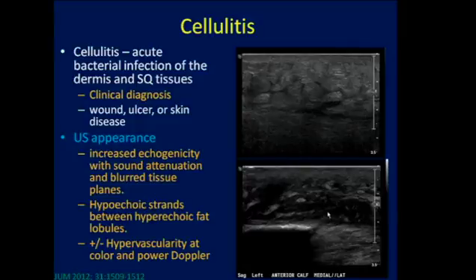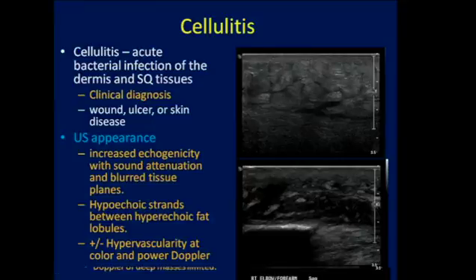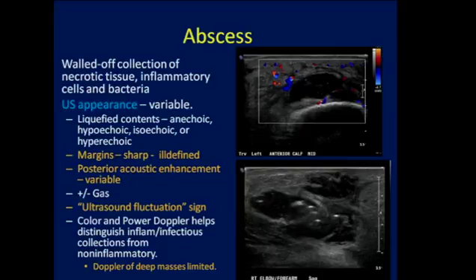This is a more chronic appearance of the same etiology. Note how the fat globules are somewhat compressed. We may or may not see hypervascularity. Well, why do ultrasound in patients with cellulitis? The reason to do it is to exclude an abscess, because the two are treated differently. Abscesses are drained, in addition to being treated with antibiotics.